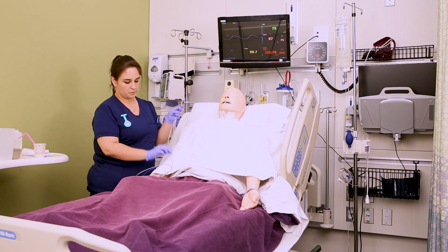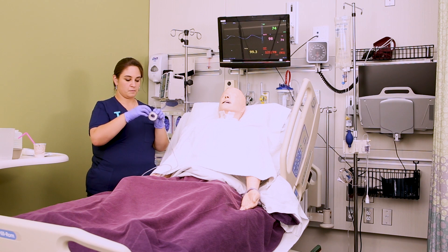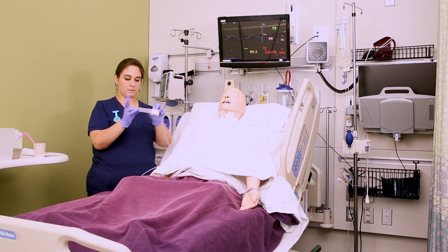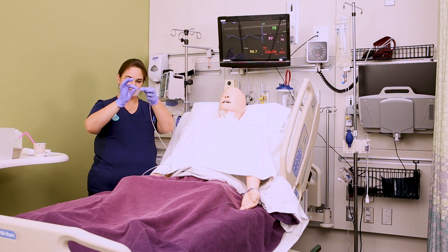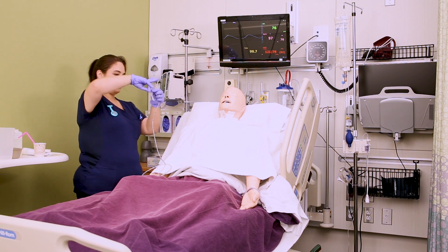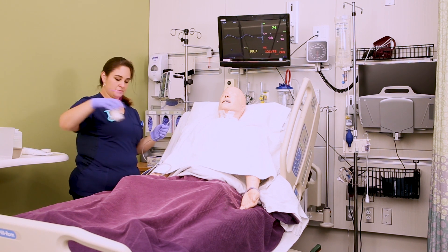You're also going to want to go ahead and prep your tape for your securing device. Rip off about a three to four inch piece of tape and then cut a slit in it about two-thirds of the way up, so it should look like a little pair of pants. I'll usually put it on the table or on the side rail, just somewhere I can grab it easily.